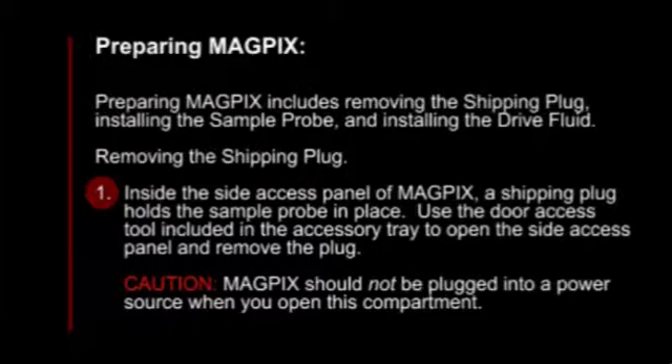To remove the shipping plug, first, inside the side access panel of MagPix, a shipping plug holds the sample probe in place. Use the door access tool included in the accessory tray to open the side access panel and remove the plug.